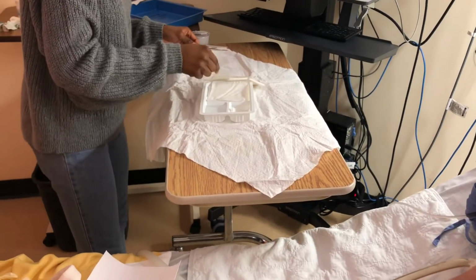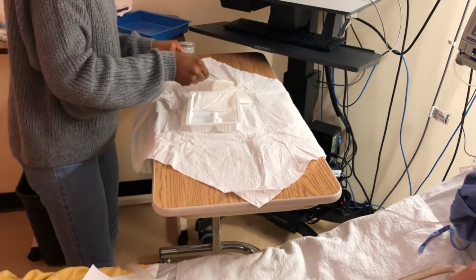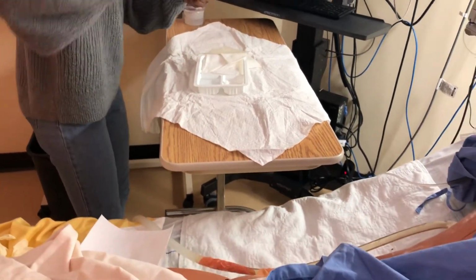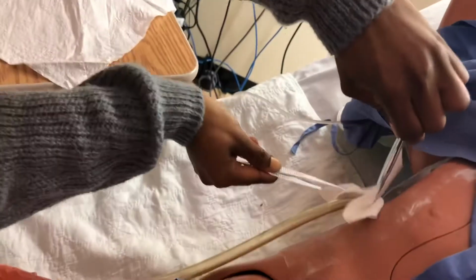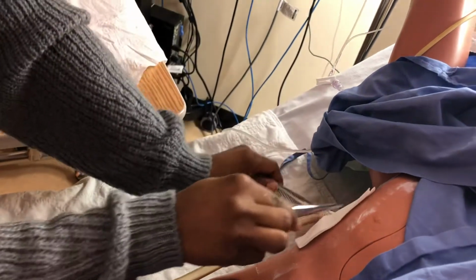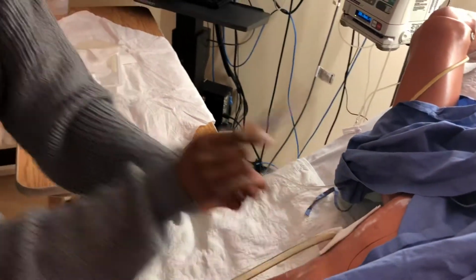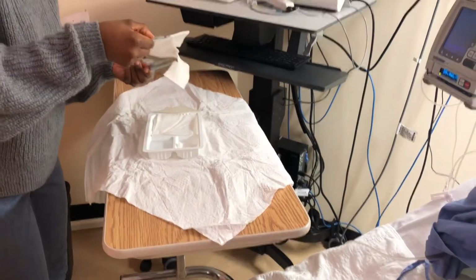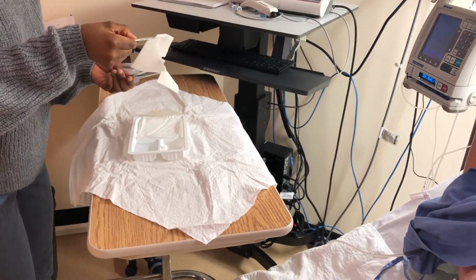Okay. And next I would put my... twist it. So put this here. Okay.